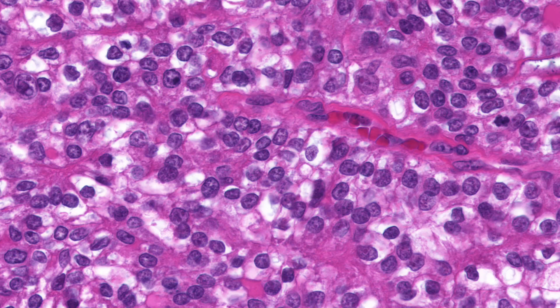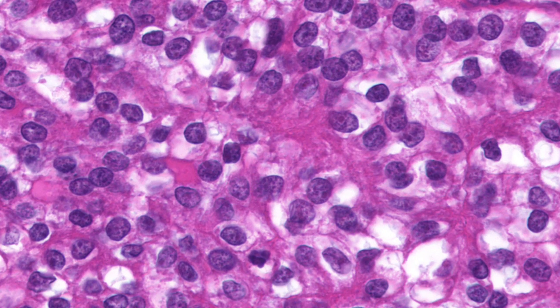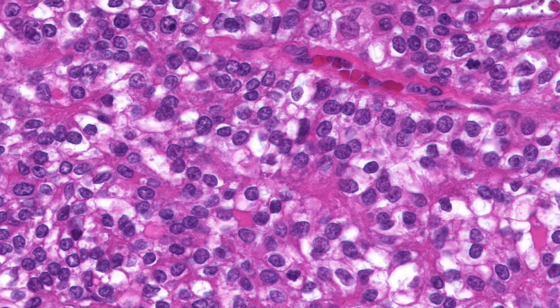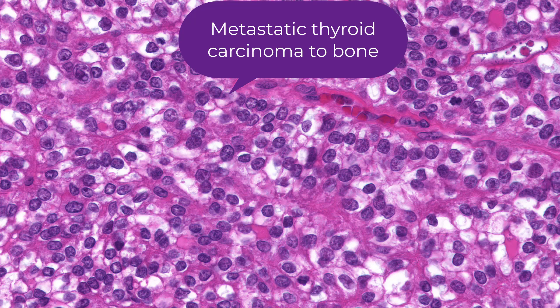Some cells may have fairly eosinophilic cytoplasm and perhaps a groove if you look carefully, and they may be keratin positive — some chondroblastomas are keratin positive. But this particular example is not a chondroblastoma; this is a metastatic thyroid carcinoma.